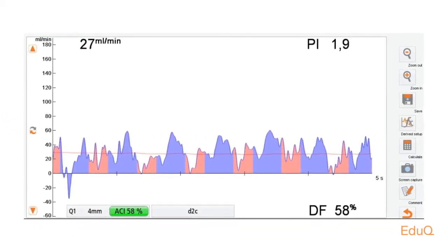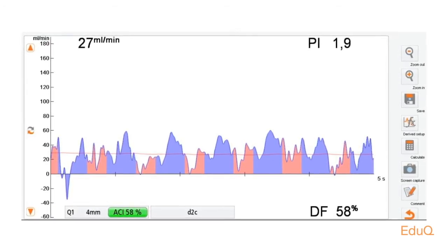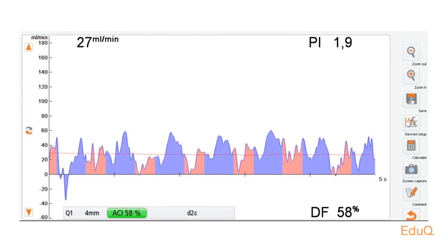On the second TTFM measurement, you can see the flow is improved and the PI is good. And then the revision turned out to be not necessary after all.